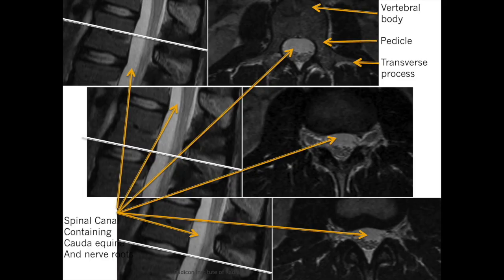To understand the impact of herniated disc, we need to revise the radiological anatomy of the vertebral body. On the left, you can see sagittal sequences with a line marking the level of axial slices seen on the right side, with arrows showing multiple structures.